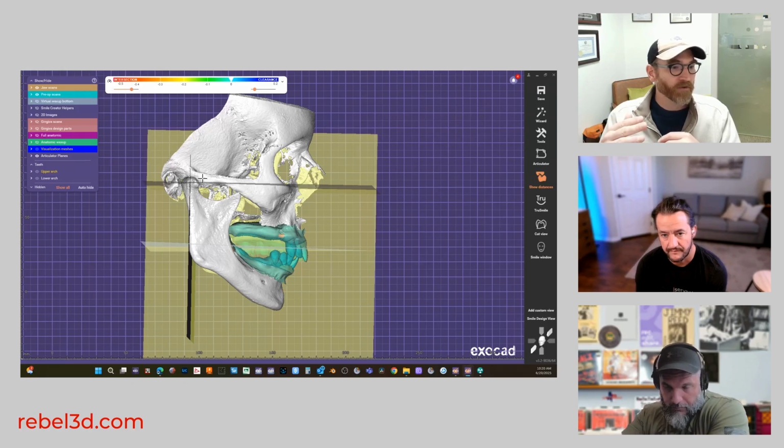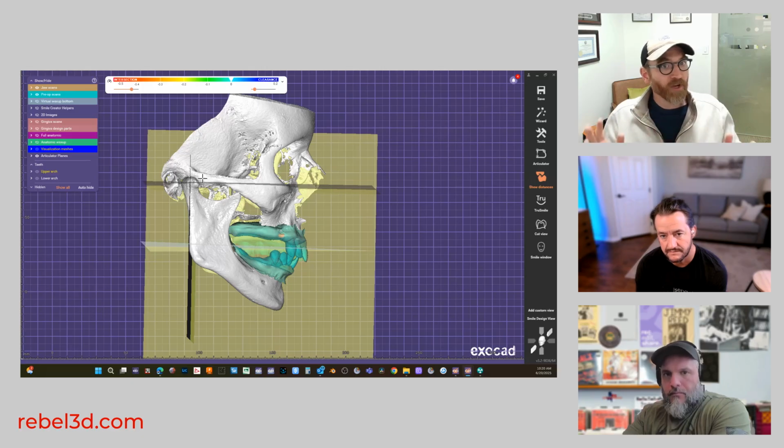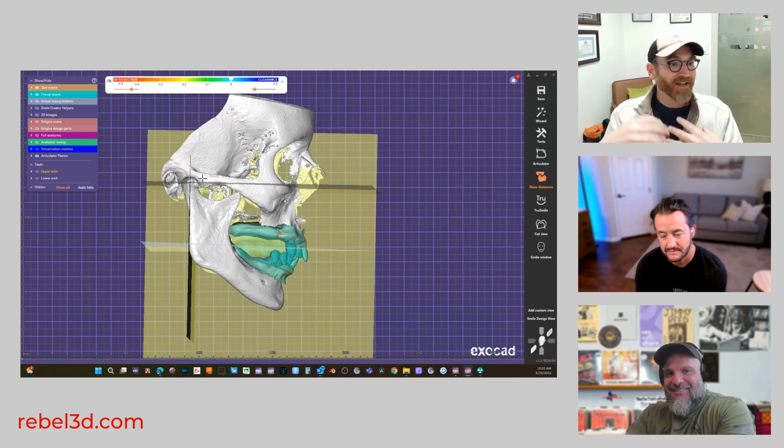And that's a workaround that is a good idea, and it's up to the clinician to determine where the mandible is going to be at that treatment position, to capture that for the technician. We don't work magic, we can't do magic, and we are absolutely confined to the data that you give us.